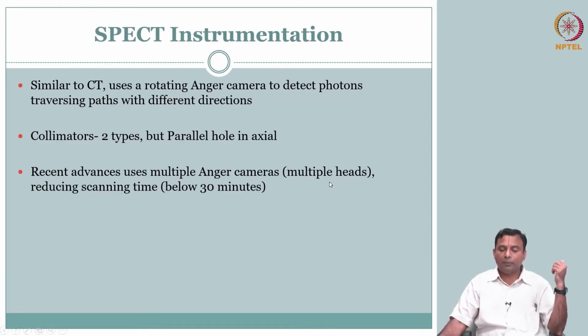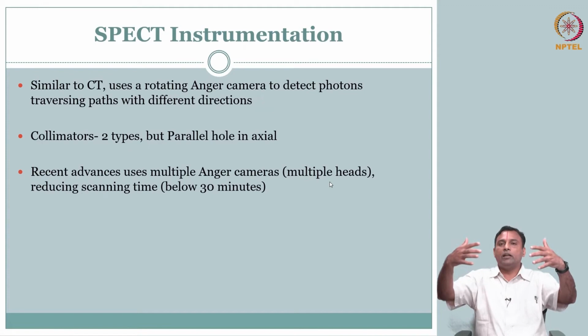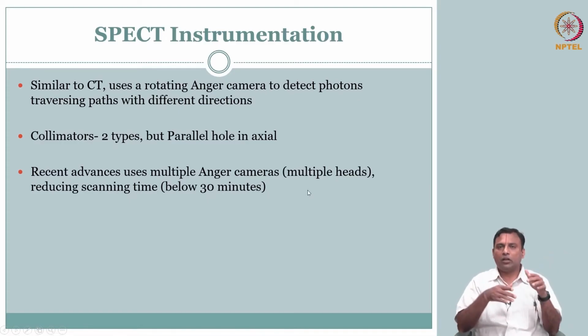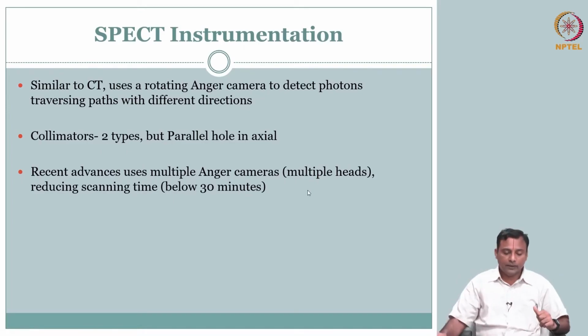So you could have multiple heads, meaning multiple planar gamma cameras at different angles, and you could record. But typically in that sense you could think about having it full throughout the body. But usually what they found is there's a trade-off, right? So it becomes very cumbersome, very expensive to do all that. So usually two heads is reasonable, especially the configuration that I showed. You can make it flat 180 degrees, so you can do a whole body scan with the same thing.